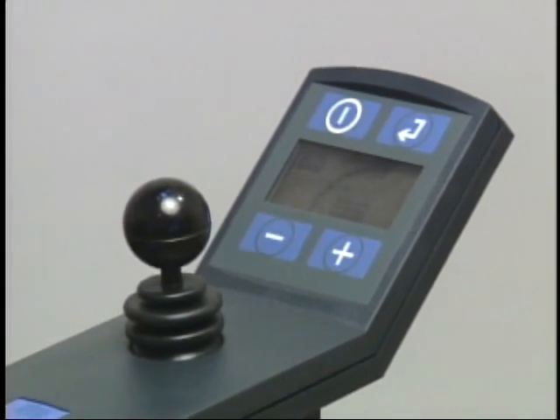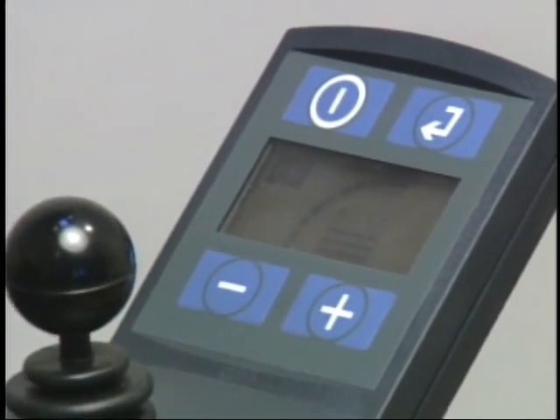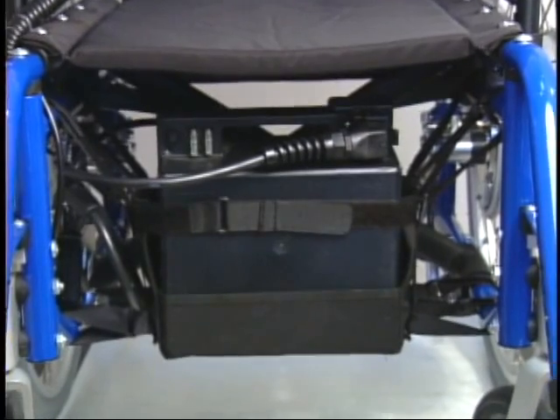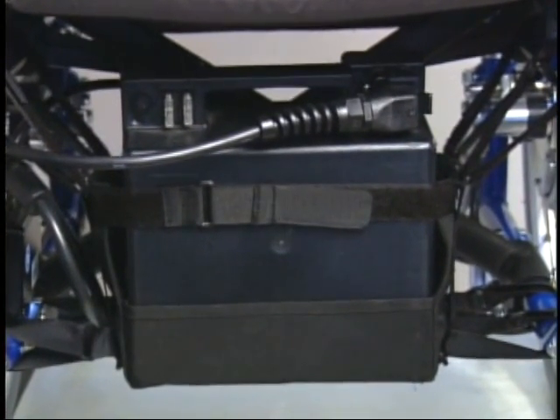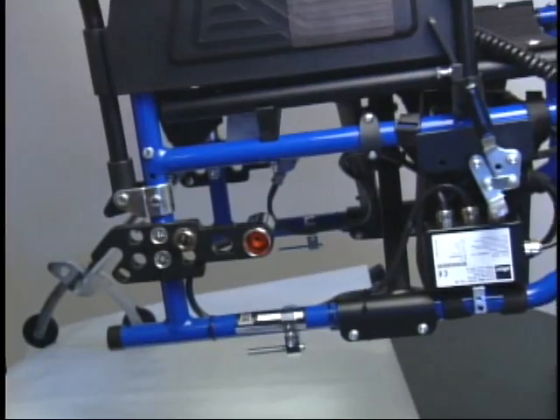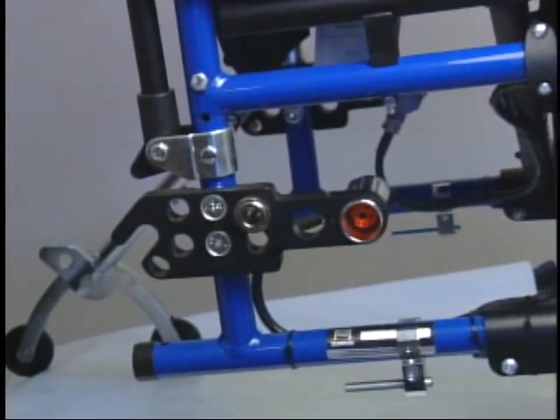A programmable joystick with LCD display. Battery pack with Velcro pouch. Automatic battery charger. And the power distributor and brackets.